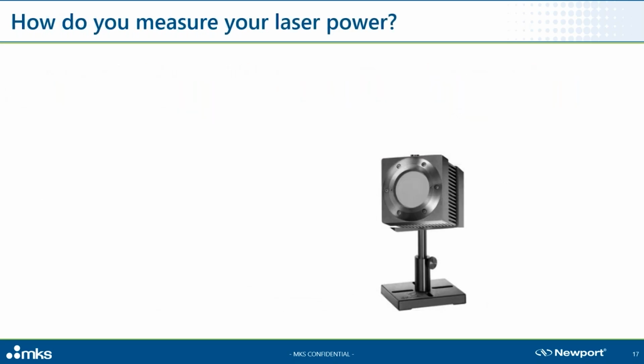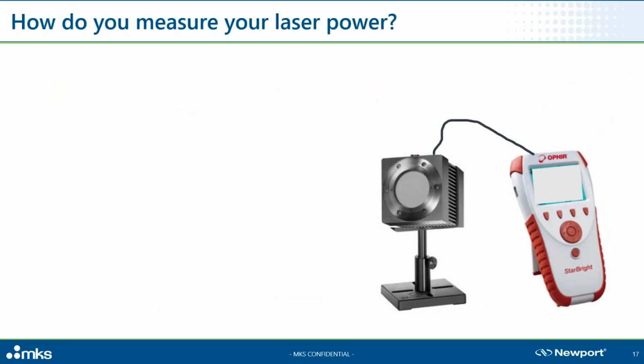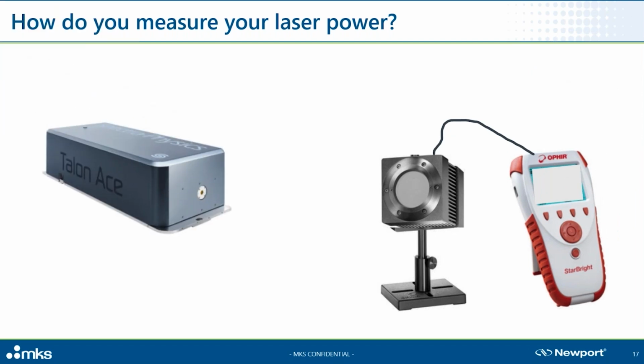Okay, you got your sensor. What do you do next? Hook up the power meter, bring in the laser, and fire the laser. Get your reading. Simple as that. In some cases, yes.